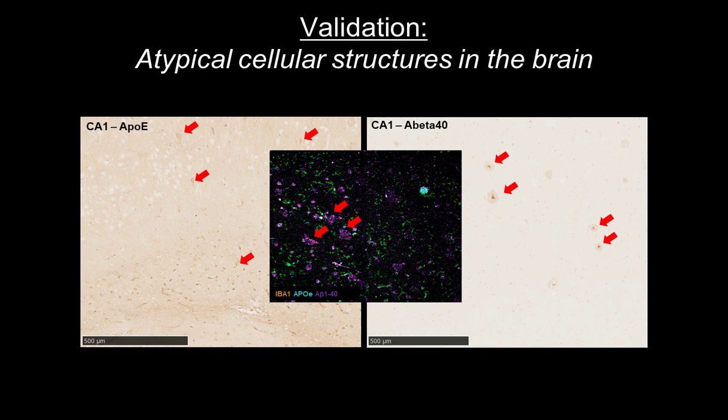Other markers, again, disease-associated proteins, which can be a little challenging to see, or plaque-associated proteins. Plaque-associated proteins are always challenging because you don't always know what the expected plaque density is going to be. And so again, making sure that you have serial sections with both the AB staining and standard colorimetric staining so you can enumerate those things. And then when we look at the multiplex ion beam imaging data, making sure that these things coincide with one another.